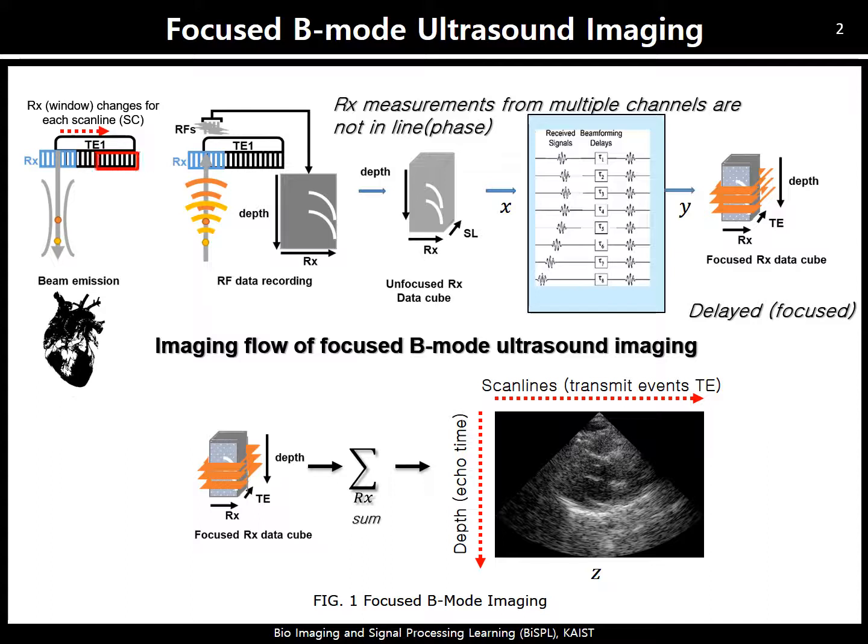As we know, ultrasound is a safe modality. Why is it safe? Because it is a non-invasive, radiation-free, and real-time acquisition imaging modality. That's why it is considered a first choice for a variety of clinical applications such as fetal or cardiac imaging. Before presenting my actual work, I would like to give you a brief introduction to the ultrasound imaging mechanism.